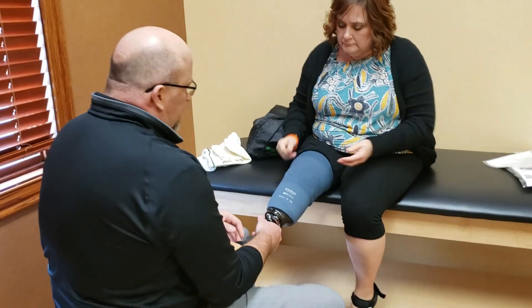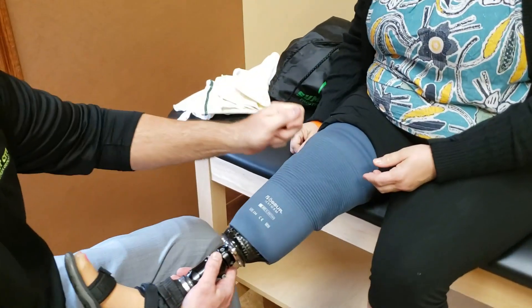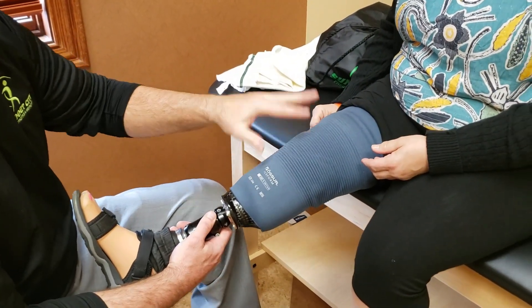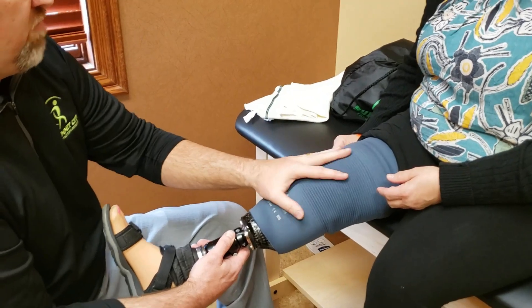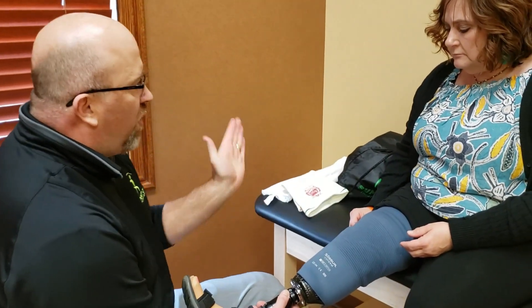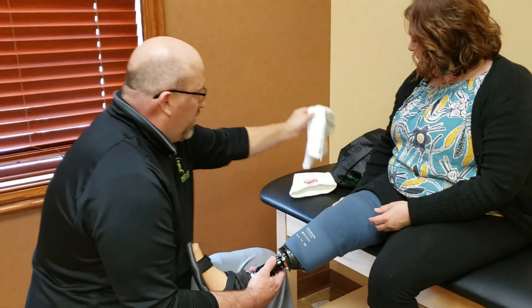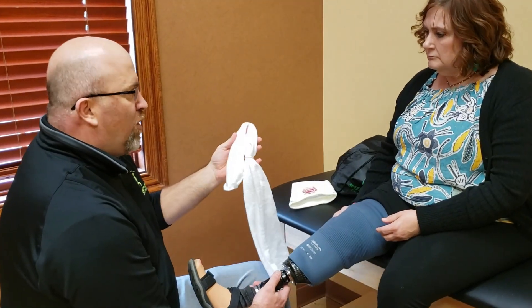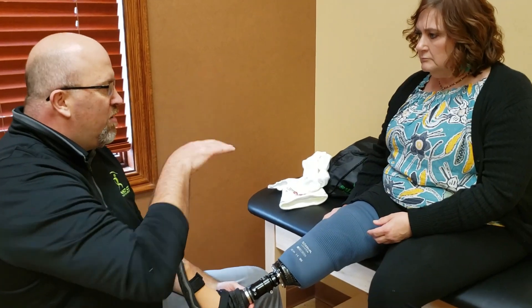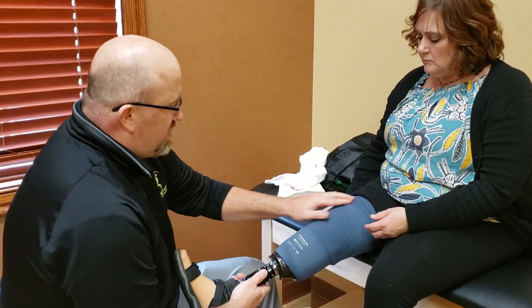The suspension sleeve goes up and down throughout daily use. Certainly in the beginning this is on and off quite a bit because we know how volatile that volume is — a lot of shrinkage means a lot of different socks throughout the day. When you go to bed at night, even though you wear your shrinker, things are going to swell back up to some extent. It's very much this cycle — up and down, up and down — but all along you're getting smaller and smaller as a user.